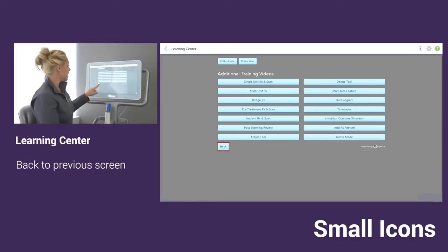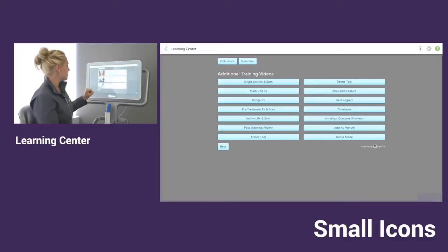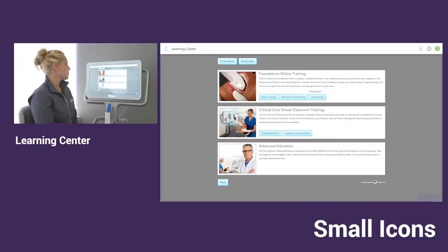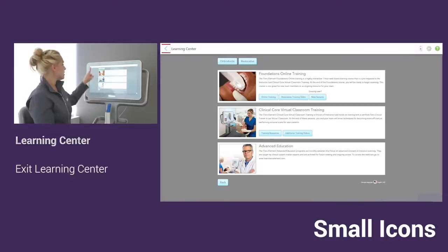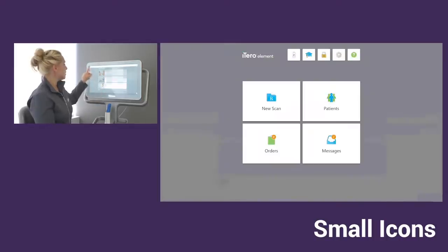To get back, I can just tap on the back option and that will get me back to the learning center. To completely exit the learning center, we can tap on the blue arrow at the top left corner.